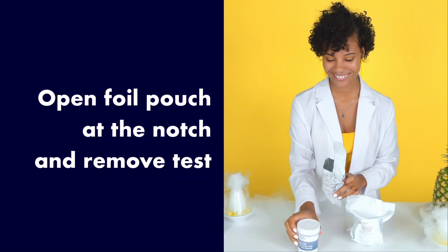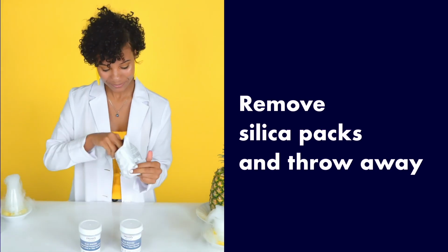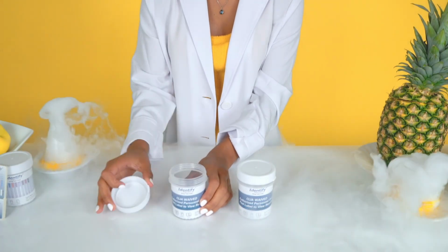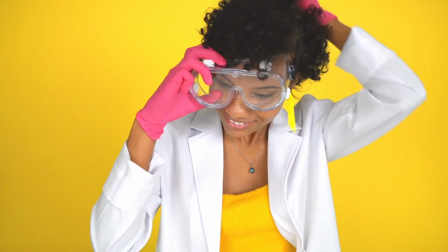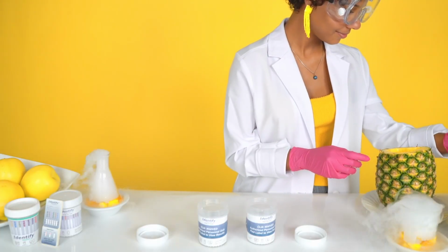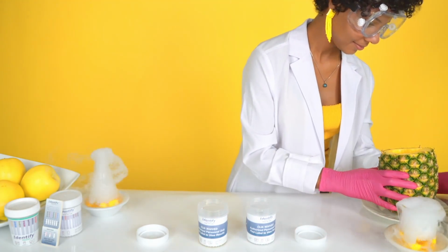First, open the foil pouch at the notch and remove the test. Grab those handy little silica packs and toss them out. Separate the lid from the cup and set aside. And hey, gloves are always good. Skylar will demonstrate with 2 urine samples, the clean kind and the other kind.